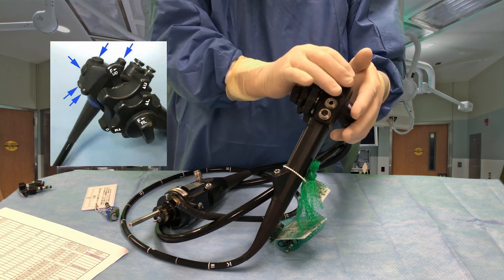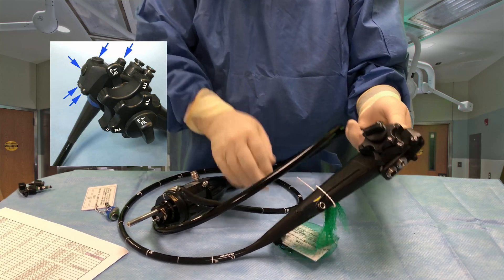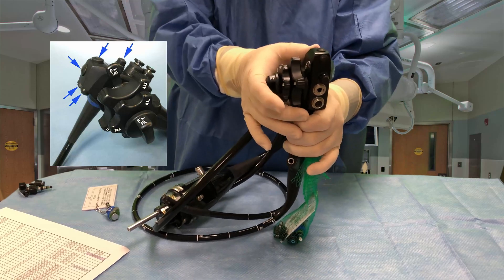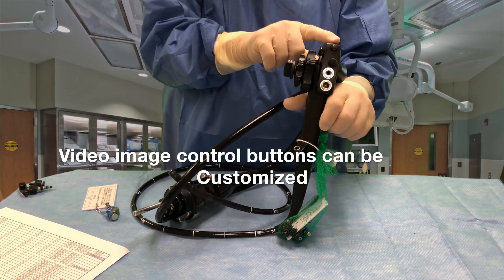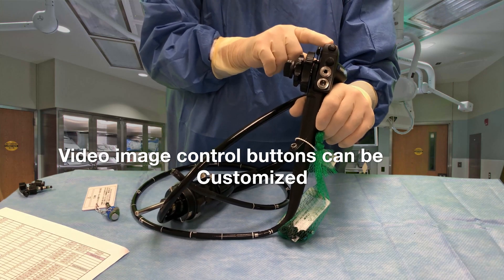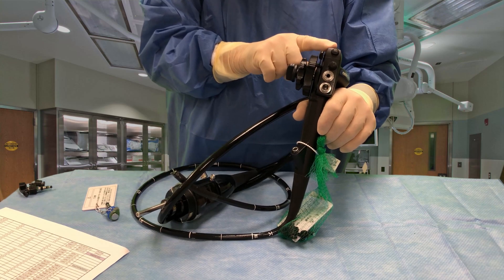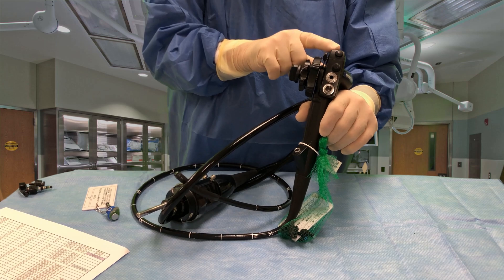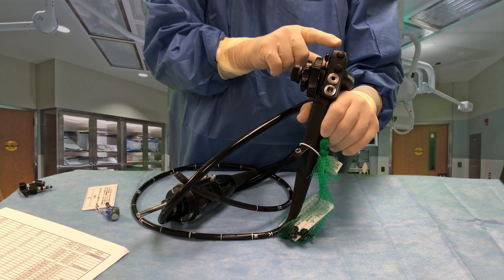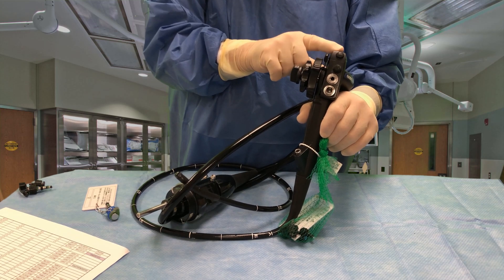It also has these four buttons up here. The one next to your thumb, if you're handling the scope, takes pictures. The one on the top takes NBI — narrow band imaging. It's a light spectrum that helps us both detect polyps and aids in the diagnosis of Barrett's esophagus.